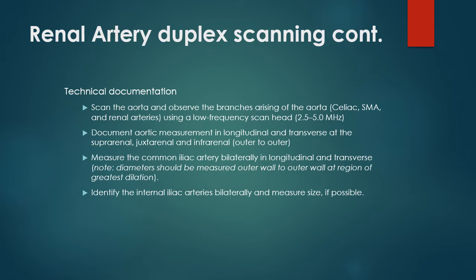When scanning the renal artery, there are protocols to follow. You want to scan the aorta and observe the branches arising off the aorta — your celiac artery, your superior mesenteric artery — and then get to your renal arteries. Use a low-frequency transducer. Document the aortic measurement in longitudinal and transverse at the suprarenal, juxtarenal, and infrarenal levels, measuring outer wall to outer wall. Measure the common iliac artery bilaterally, and identify your internal iliac arteries bilaterally and measure if possible.